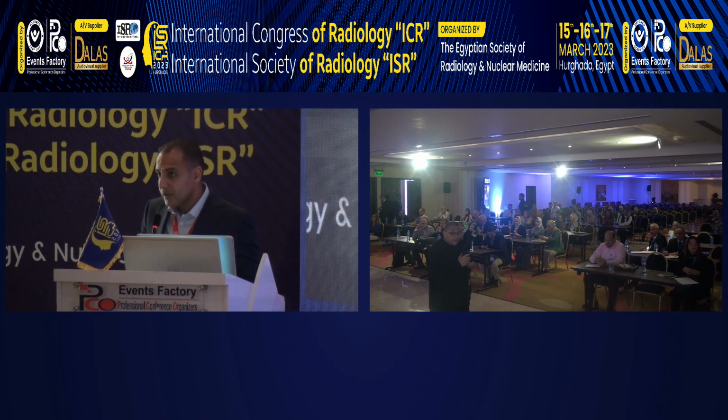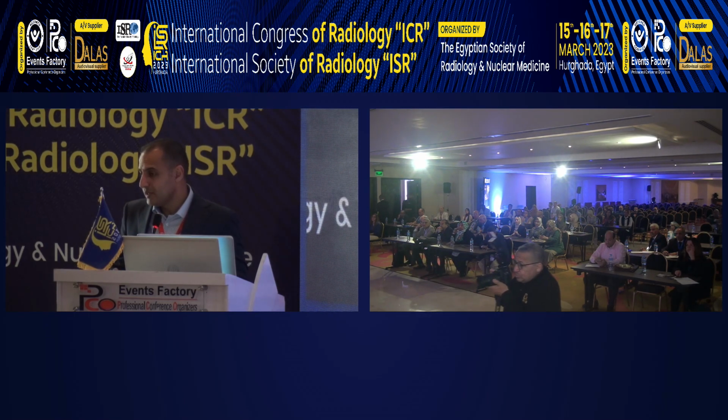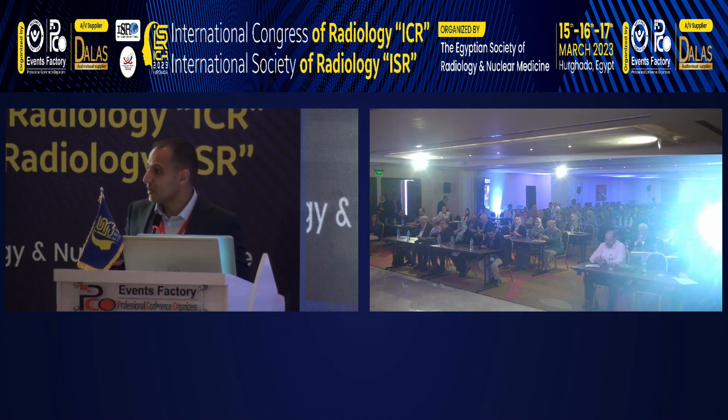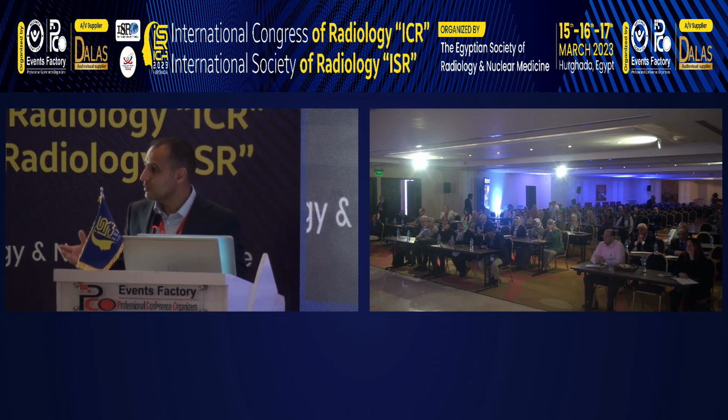Thank you. This is an important issue. In real life, the indication will be pain. Sometimes they are looking for a metastatic process. I work in a cancer center, so the whole issue is that they want to exclude any metastatic process. Sometimes in a PET scan or bone scan, there will be enhancement at the region of the shoulder girdle, so they want to analyze this more. So in my case, contrast is mostly incorporated as routine protocol.